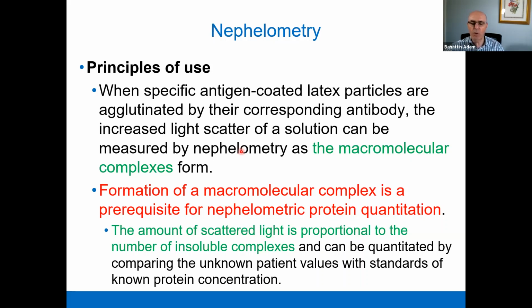In order to measure via nephelometry, a macromolecule complex between antigen and antibodies should be developed.